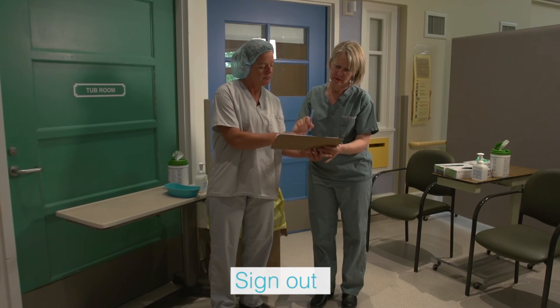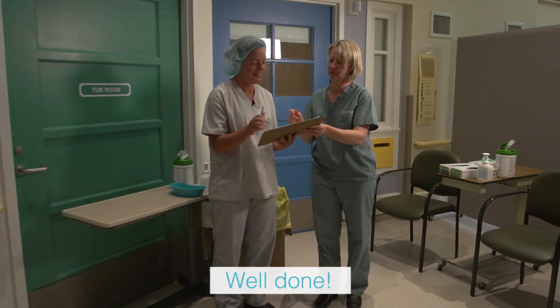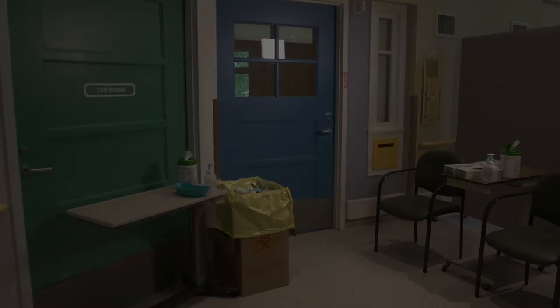The health care provider and trained observer sign out in the logbook prior to leaving the area. If your shift is over, proceed to the change area to remove scrubs and have a shower.